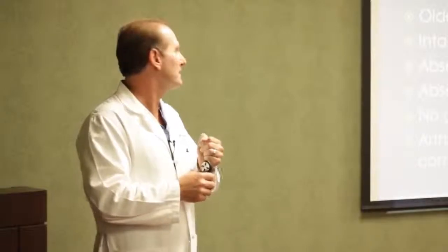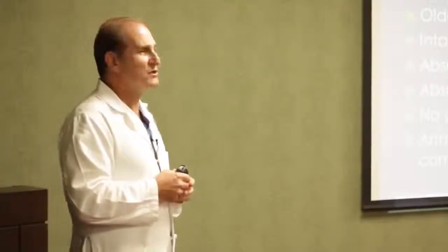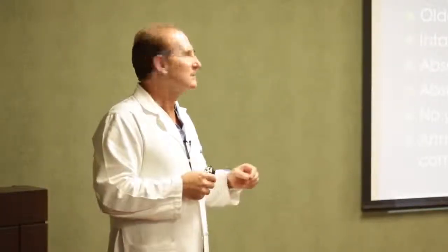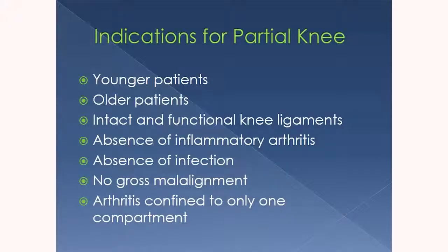But just as importantly, all of the modern total knee replacements that are available on the market involve cutting at least one of the ligaments in the knee, which is called the ACL. And so if you cut a ligament in the knee, there is going to be some motion in the knee or some looseness that wasn't present before, which isn't the end of the world. We have ways that the mechanical engineers have figured out to get around that. But if you can implant a part of the knee that doesn't cut any ligaments, which is what these partial knee replacements do, and leave your normal ligaments alone, and leave the rest of your knee alone that's not involved with arthritis or disease, that would seem to be a pretty good choice.